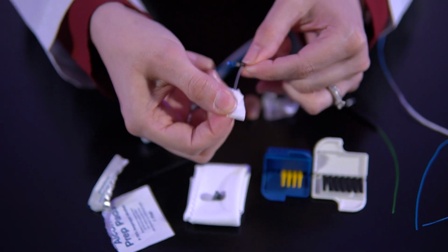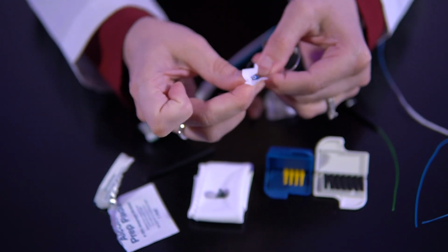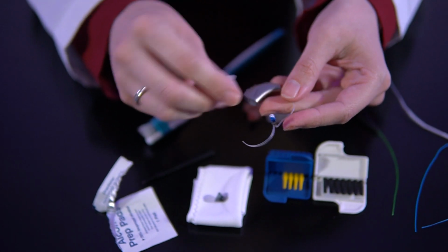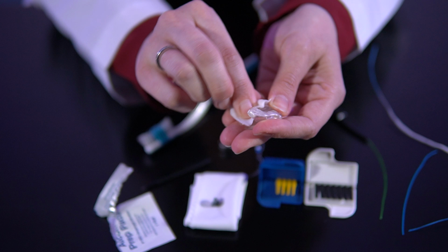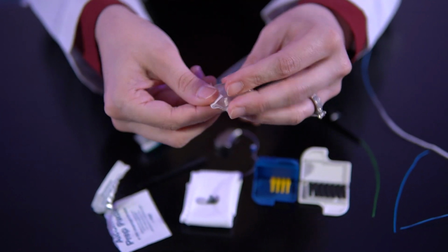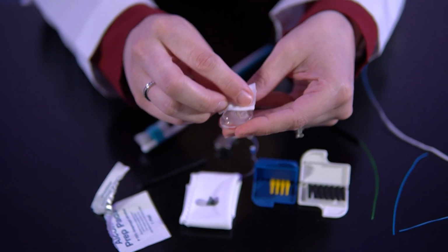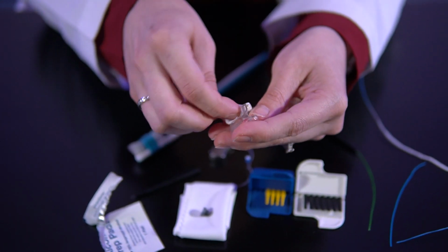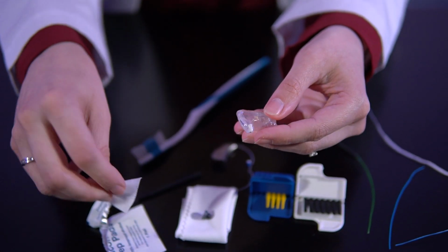I'm gonna clean this tail, or what I like to call the kickstand, because it can get wax on it. Clean your receivers. Just make sure it's got a really good wipe down. Same with the custom pieces. Get inside the grooves, because those are gonna get built up with wax and dirt and debris, and your faceplate of it, especially if you've been outside working in the Oklahoma heat, working in the garden, it'll get dirty, okay? So we're gonna wipe it all down.